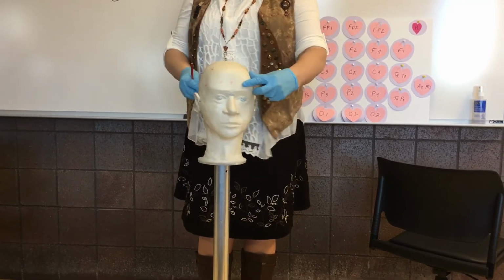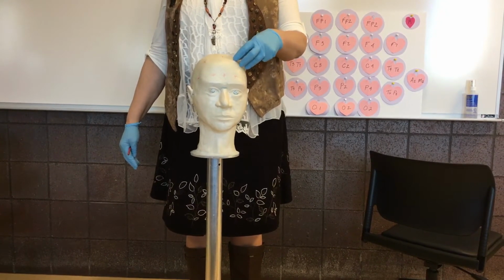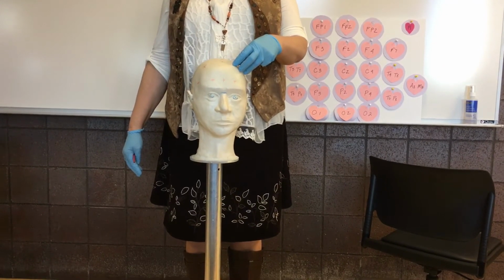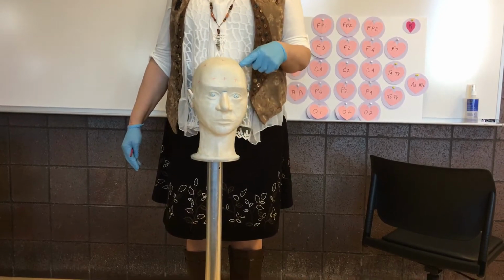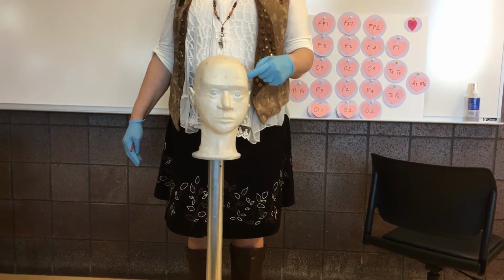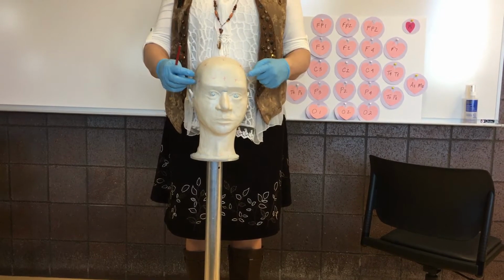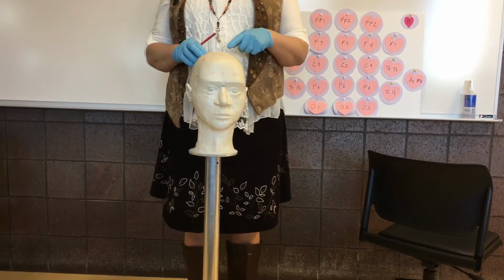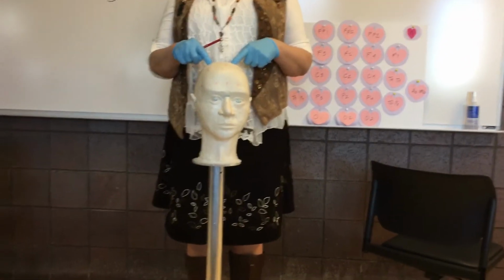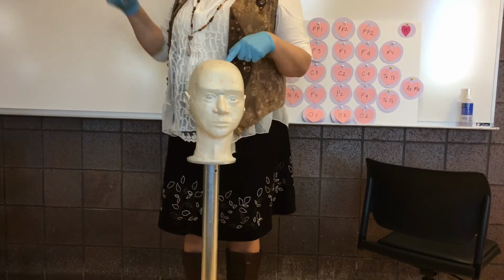If you move an electrode, say they have a big open skull fracture and you can see underneath their skin here. You're not going to measure and put an electrode there, are you? You're going to move it. If you move it laterally to avoid it, you're going to move this one laterally. Make sense? If you've got something here, if you move it medially or towards the midline, you're going to move this one medially, the equal amount. Make sense? Then you document it on your head diagram.